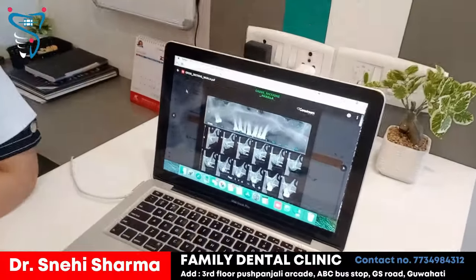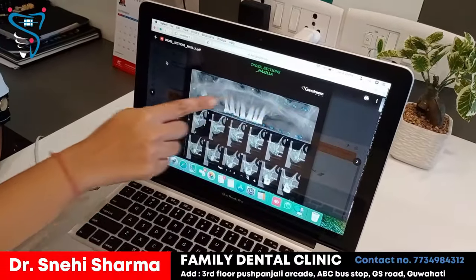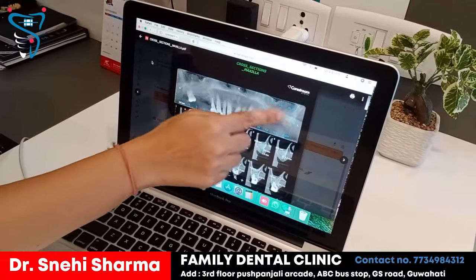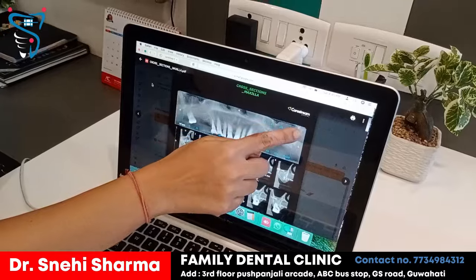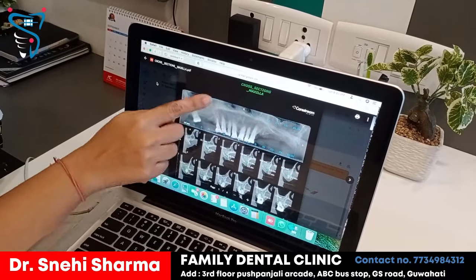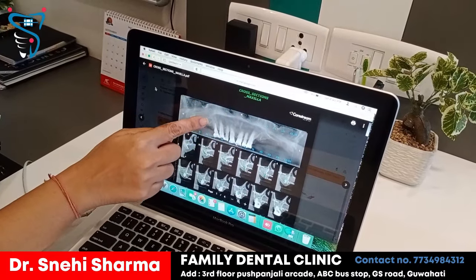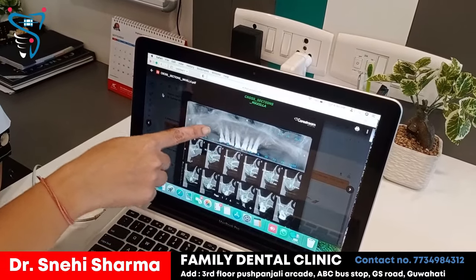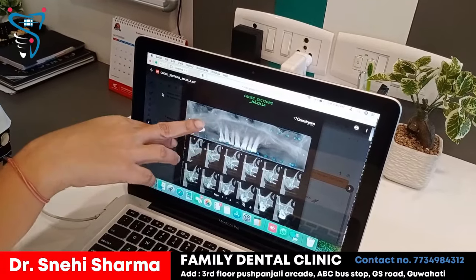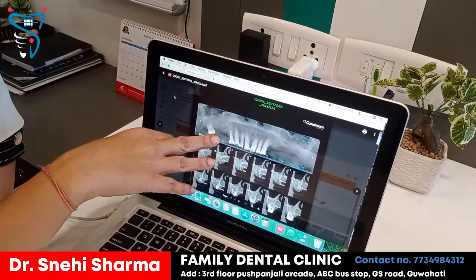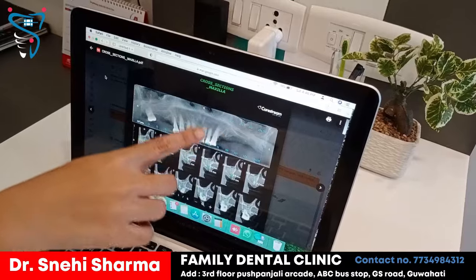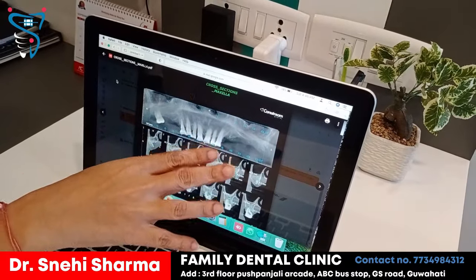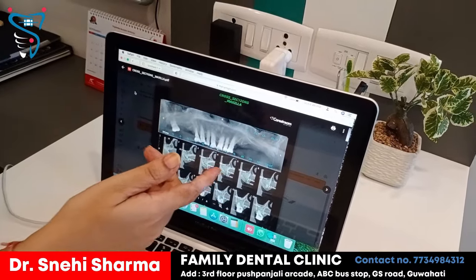This particular patient whom I'll be giving dental implants to does not have teeth in his posterior, or the back tooth region. In the CBCT, I can clearly see that his sinus has come down on both sides. Here we still have a little bit of bone left, so I've planned two dental implants along with an indirect sinus lift. Here the sinus has come comparatively much further down, so I'll be giving him a direct sinus lift and after that I'll be giving him dental implants.